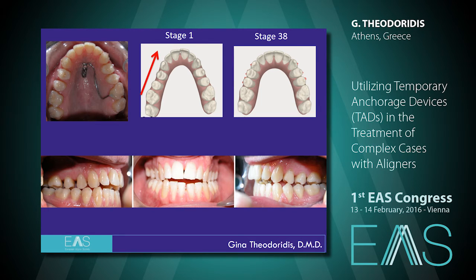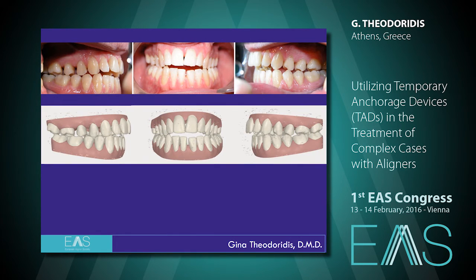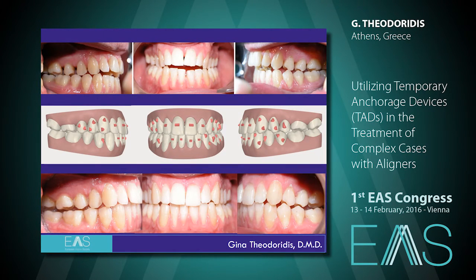So this is the start of Invisalign. This is a screenshot of the initial situation, and this is the predicted ClinCheck outcome. And this is the real situation when all the aligners of the first group finished.